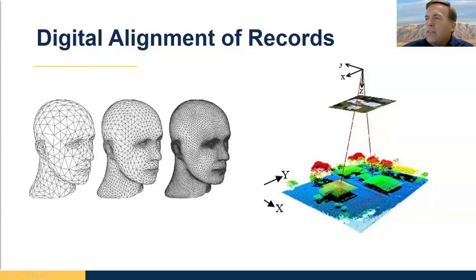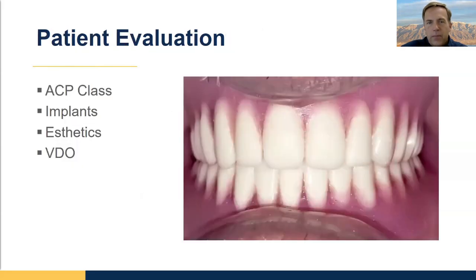The other thing that you need to think about is there are going to be times where you need to create a file that really isn't necessary to make whatever prosthetic you need, but it's a transitional one that allows two of your important files to be related to each other. To get back to our iOS example, you could think of the bite scan as a transitional scan because you're not really going to use it in the design process, but it's necessary to get the upper and lower arches oriented to each other. So anyhow, enough about that.